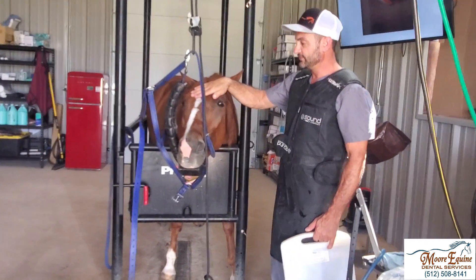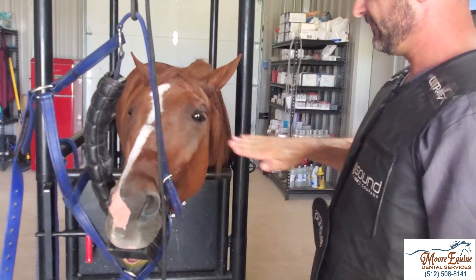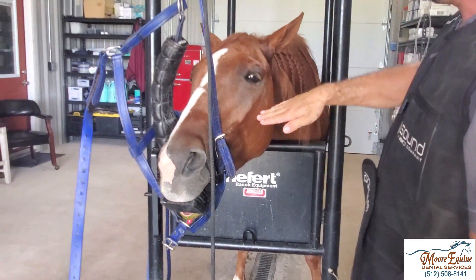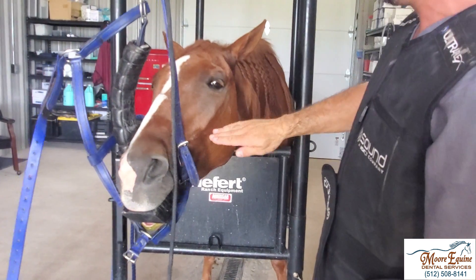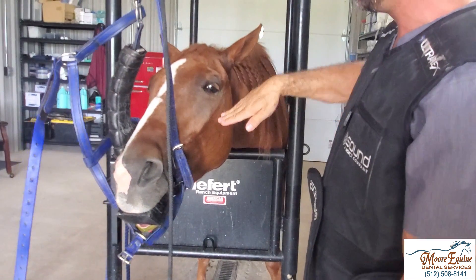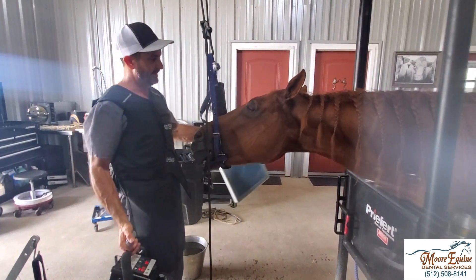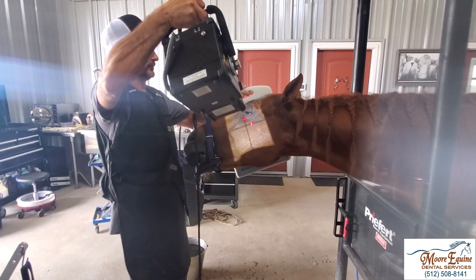What we want to do is — if this is a straight lateral, you always want the cassette on the side that has the bad tooth. Straight lateral would be right here, and you just want to oblique maybe about 45 degrees up from straight lateral. All the way would be 90 degrees, so you're going to go about 45 degrees. I've got the open mouth block inside, I'm going to put the plate on the side of interest toward the number 10, and then shoot about 45 degrees.